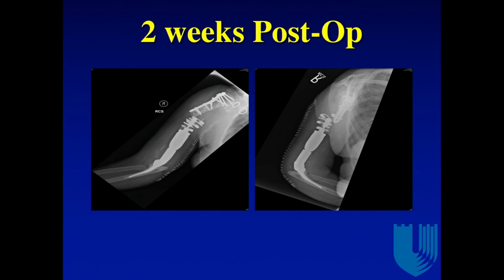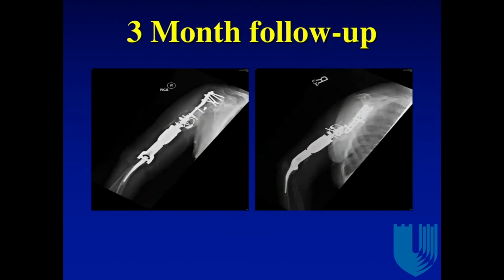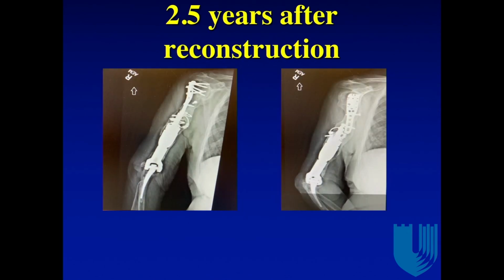2 weeks post-op. If that isn't getting kicked in the, you know what, there's not much worse. So this is the patient 2 weeks post-op with a fracture. So now what? Well, we attempted to put the head in the sand again, so this one goes into a fracture brace. 3-month follow-up, maybe. Bone stimulator, maybe. Here she is at 2.5 years with sufficient bone to allow her to come out of the brace.